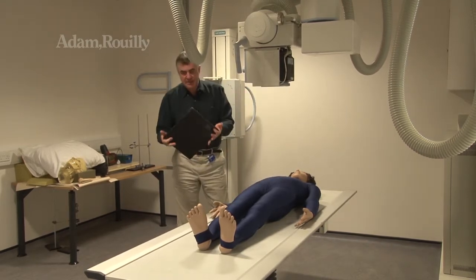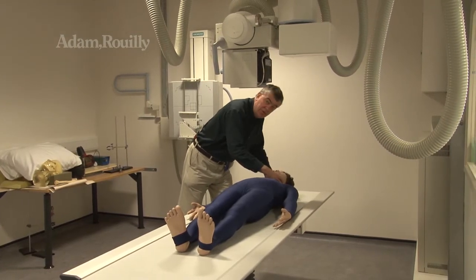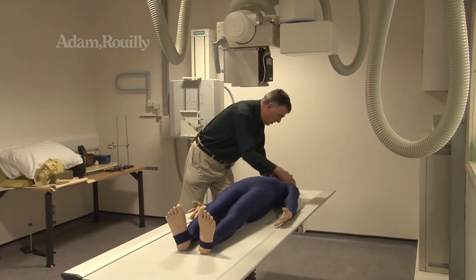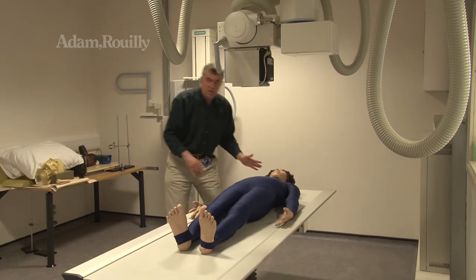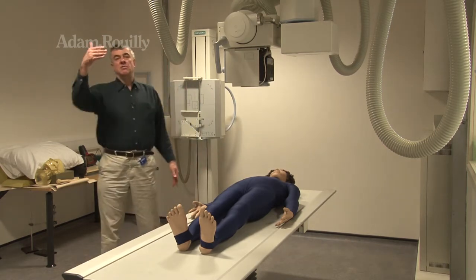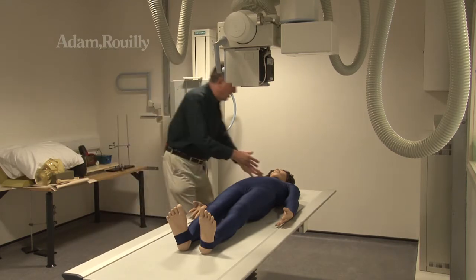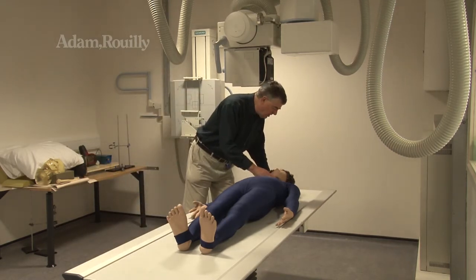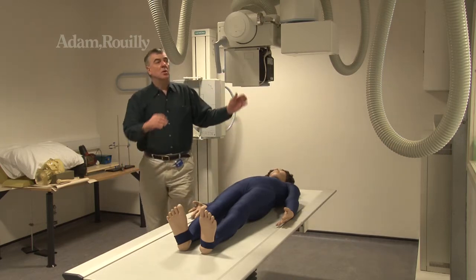So I have a plate which I will position under the head and position the head in accordance with radiographic practice. This is called an AP view, that stands for antero-posterior, but effectively it's a view from the front, so you're looking at somebody face on. I make sure that I include all of the head and the jaw, and we'll get the upper part of the cervical spine on as well.